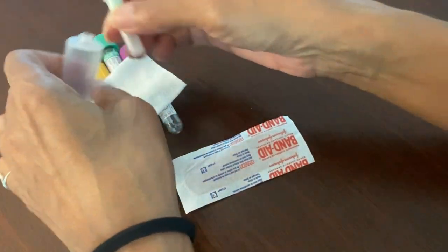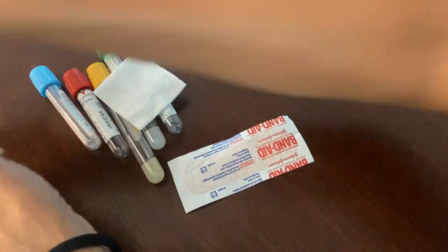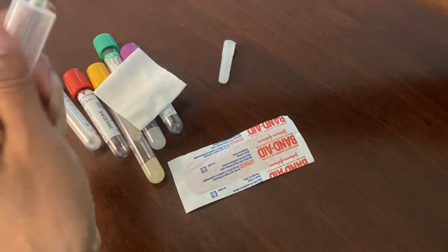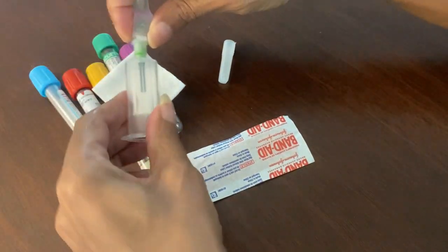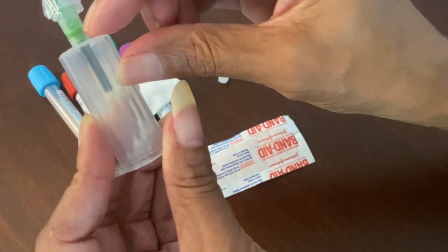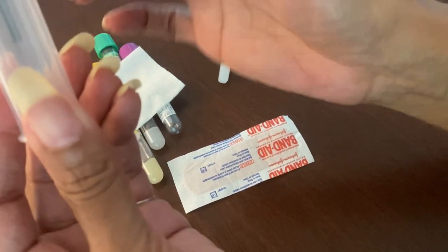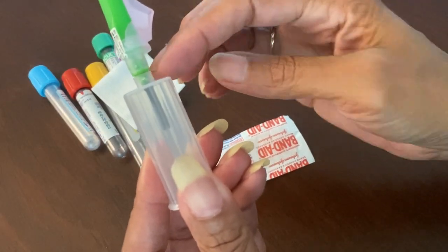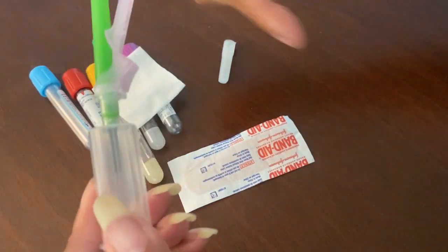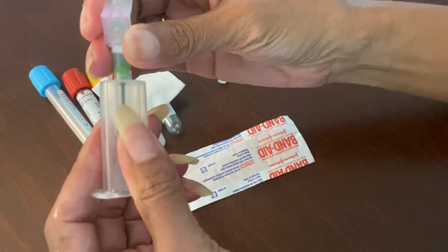Go ahead and attach your needle to your holder. Make sure it's flush — I hope you guys know what I mean. Don't have any gaps here, because that will cause blood to come through and you'll wonder where it's coming from. Always make sure it's pretty secure, but don't go being Hercules — you can break it. Just enough; you'll know what feels right.